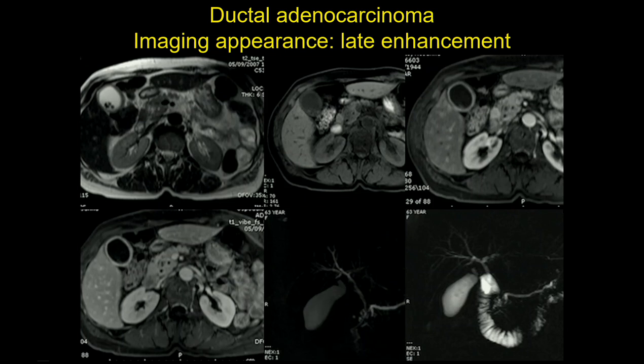Sometimes, especially when small, this tumor can show late enhancement, so you must be very aware of the timing of acquisition. If you acquire too late, you can miss the pancreatic phase and miss this tumor. This lesion was easily appreciated in the unenhanced and arterial phase, but in the venous phase there is homogeneous enhancement, making it quite difficult to see.